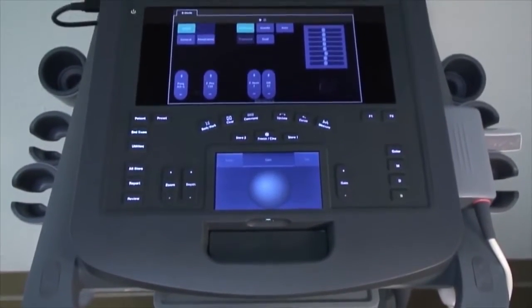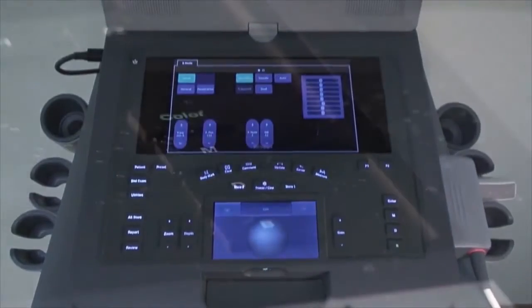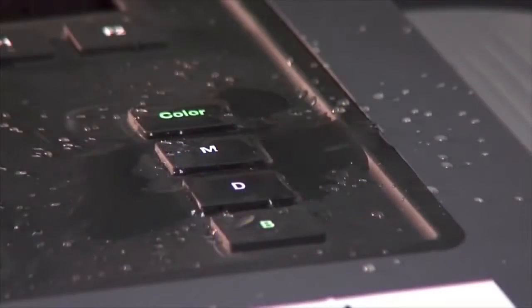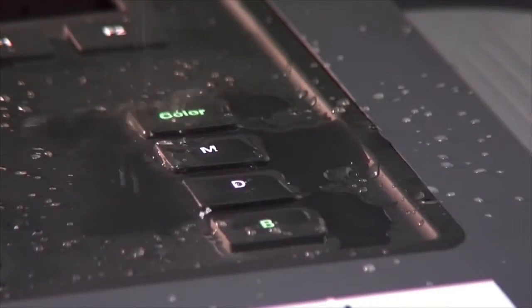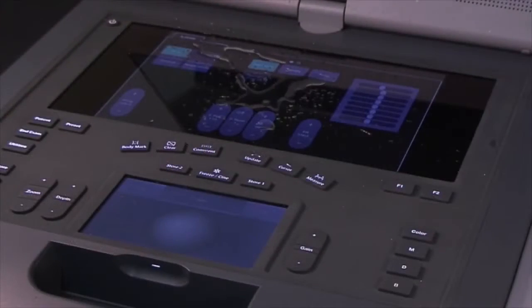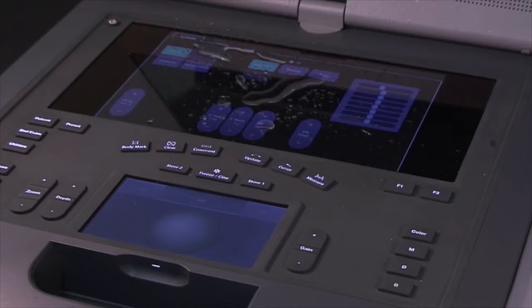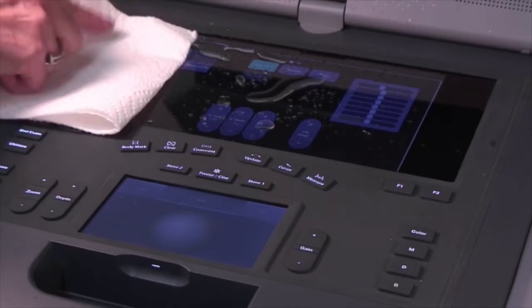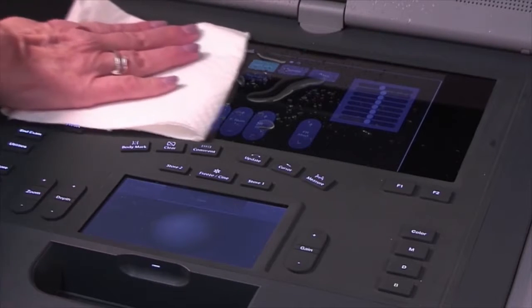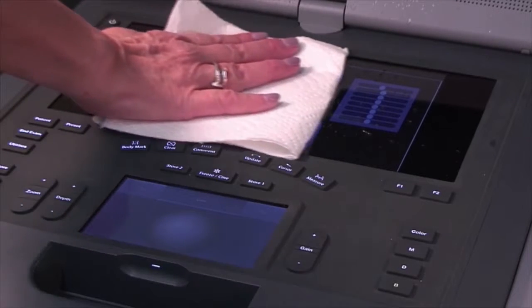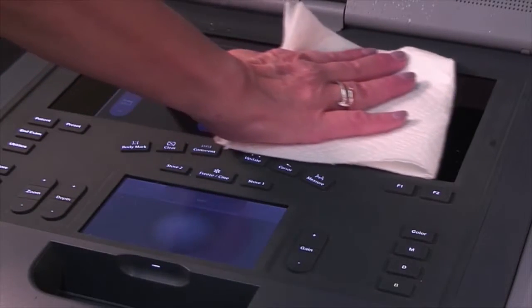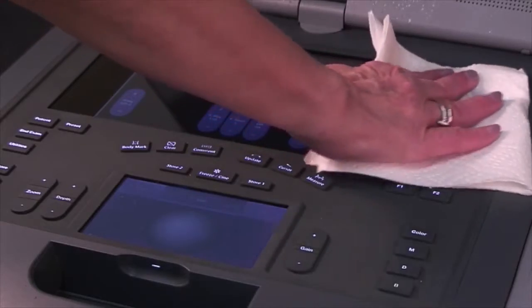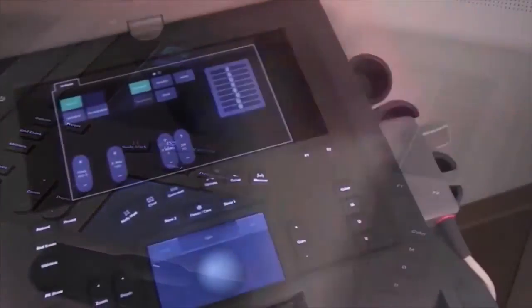The control panel is completely sealed. Incorporating dual-touch screen panels, we've eliminated the trackball and other hard keys where dirt and gel can collect, making the system easy to clean and aiding in disinfection.